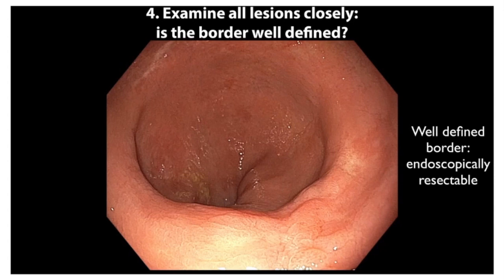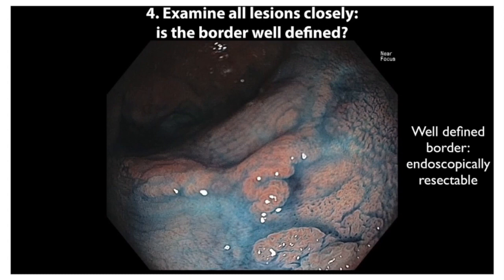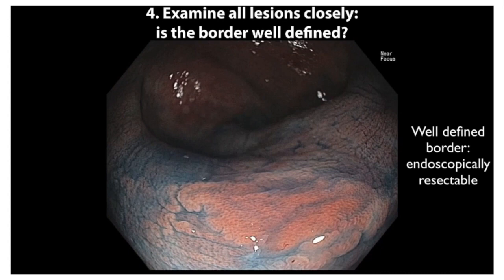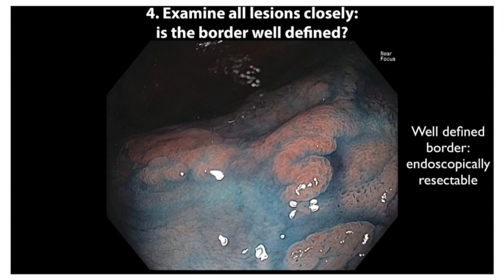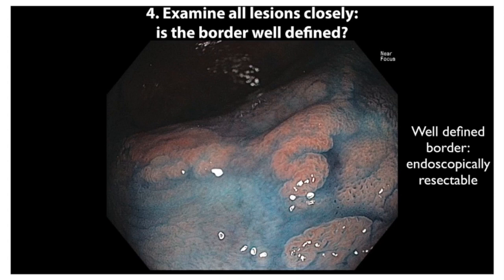Here is a patient with quiescent UC undergoing routine surveillance. A slightly elevated lesion is poorly visualized with high-definition imaging in a colitis-involved region. Upon application of dilute indigo carmine, a large flat neoplasm is well seen with discrete margins, appearing much larger than initially predicted by white-light imaging. The lesion was felt to be endoscopically resectable and was removed with ESD. Histology confirmed low-grade dysplasia. Endoscopists with less experience in EMR or ESD may consider referral to a more experienced endoscopist or surgeon after patient discussion.